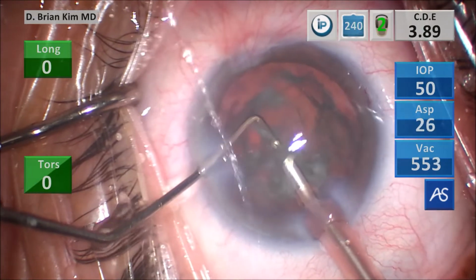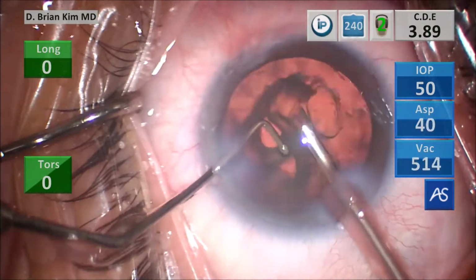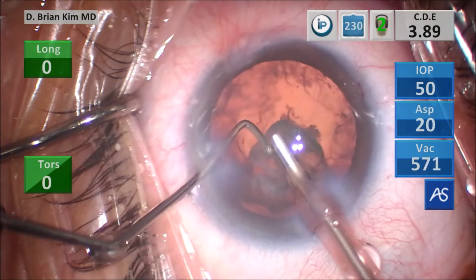You can see this epinucleus is really, really thick. Just taking my time, keeping that chopper deep in the bag, removing this thick epinuclear material here, just using some high vacuum and then some pulses of ultrasonic energy as needed.